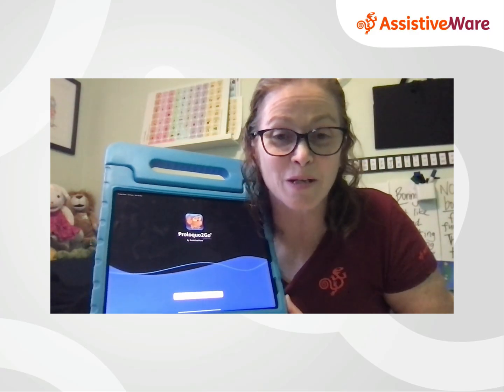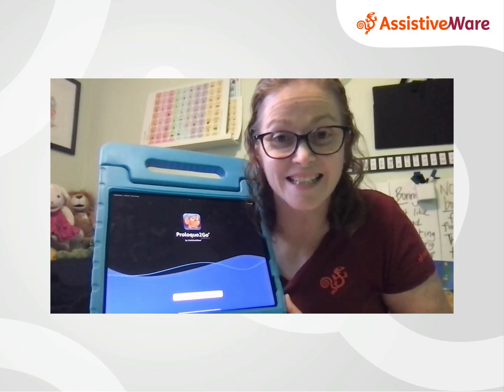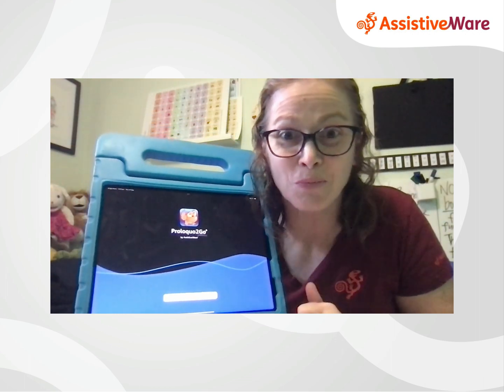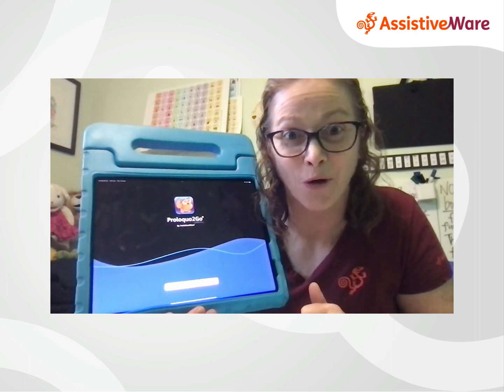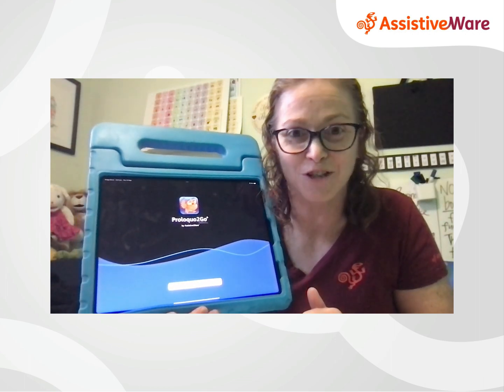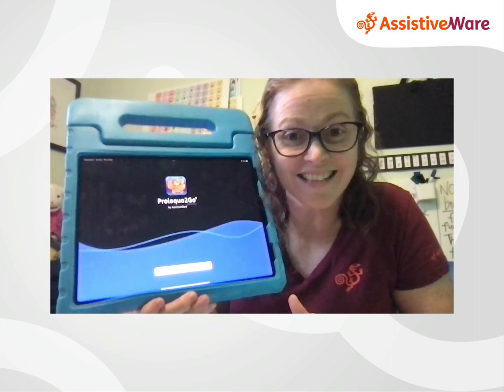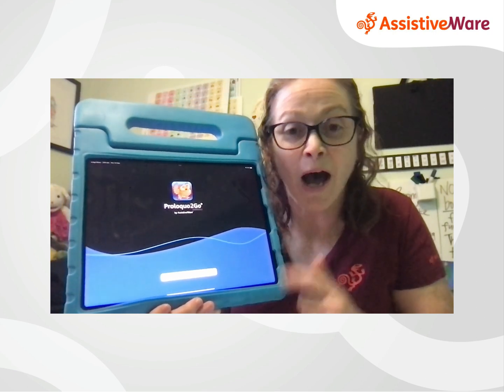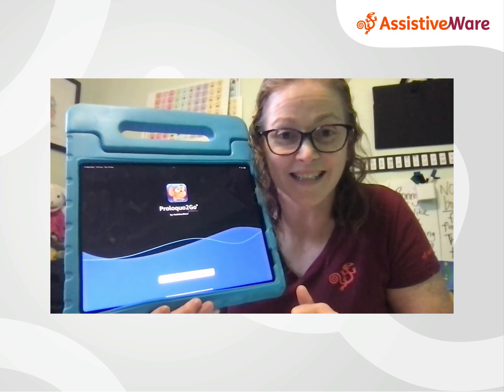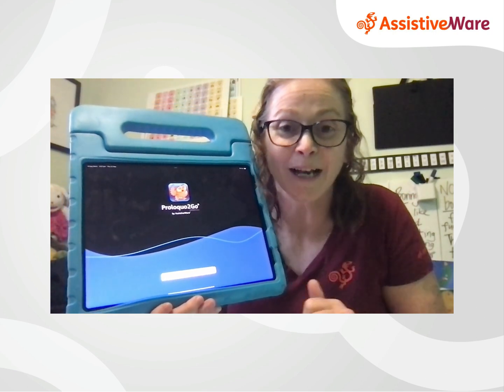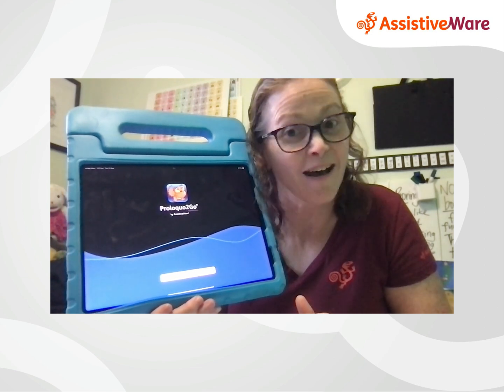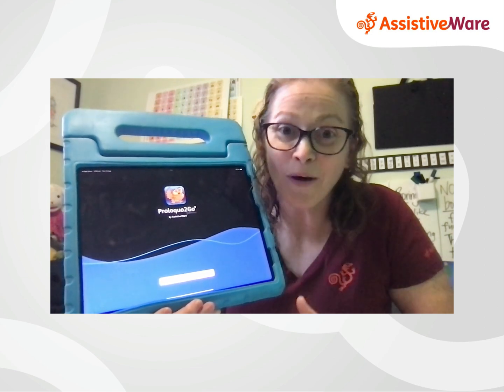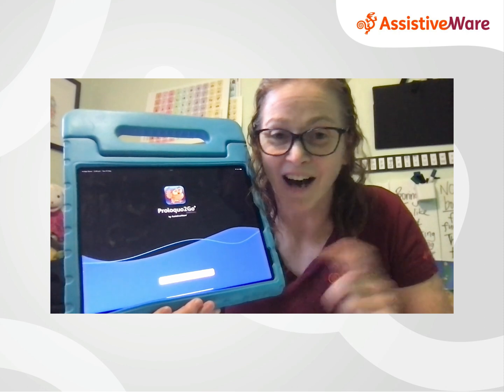Hi, I'm Amanda Hartman, speech pathologist with AssistiveWare. Have you just installed Proloquo2Go for the very first time? Maybe you're at this Get Started screen. I'm going to take you through the opening steps to set up Proloquo2Go for the first time. So let's go over to the iPad and get started.